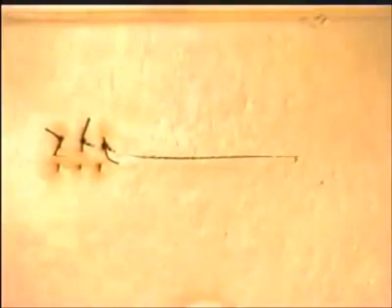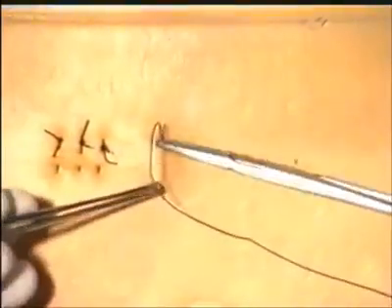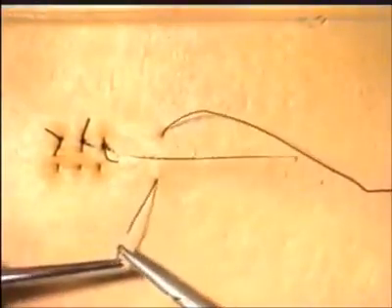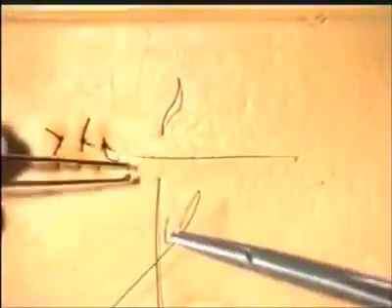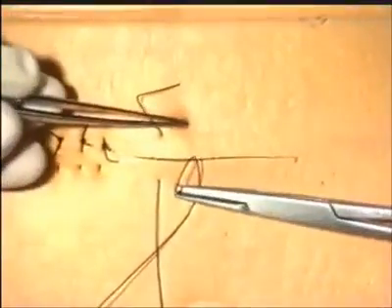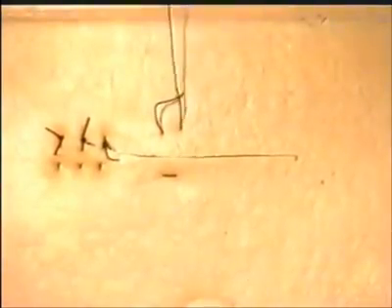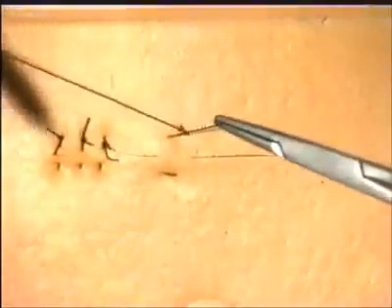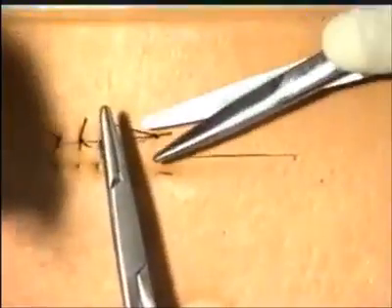We will now demonstrate the horizontal mattress suture. The initial suture is as before. Again, reverse the needle in the needle holder, but on this occasion, move slightly horizontally, and go back to the other side of the incision in a similar manner. One can see very clearly why this is called a horizontal mattress suture. Once again, the reef knot is tied in the standard manner, and the suture material cut.